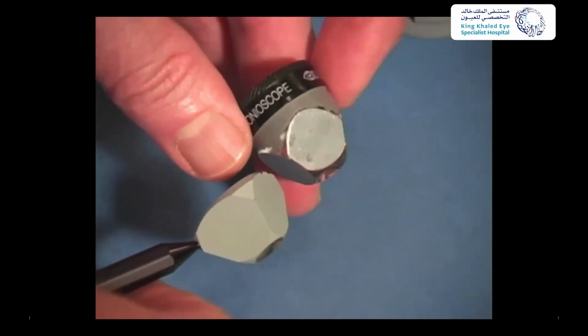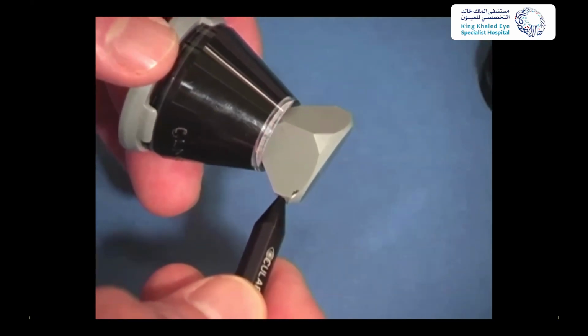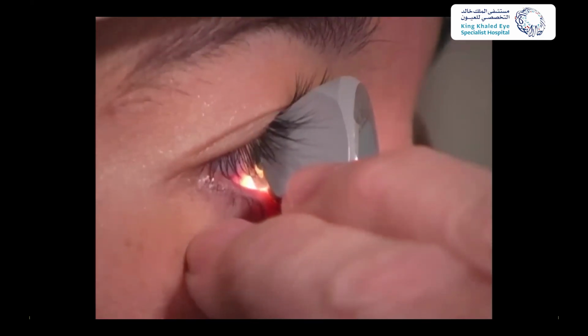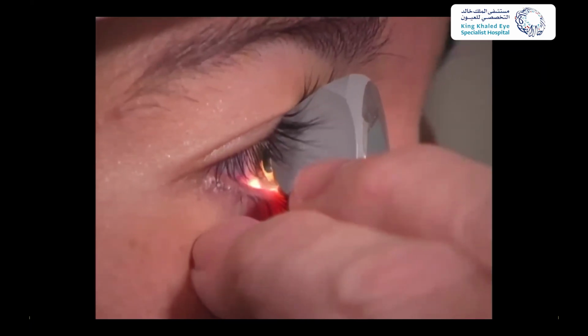So you need a lens that's small, a Sussman or a Posner style lens. You can see compared to a Goldmann lens, a Goldmann has a much bigger area. And you don't need to use the big muscles on your back to do this. I'm just pushing gently with my index finger and thumb and pushing the iris back.